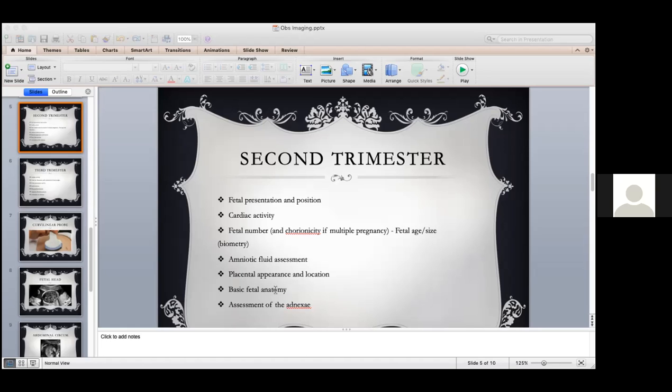Then you come down to the abdomen. You look at the abdominal structures. You want to rule out things like omphalocele, gastroschisis. You want to see presence of both kidneys. You want to assess the bladder of the fetus. Because sometimes you are actually able to see a fetus that has like obstruction, urinary tract obstruction. So they have hydronephrosis and they will have a distended bladder.